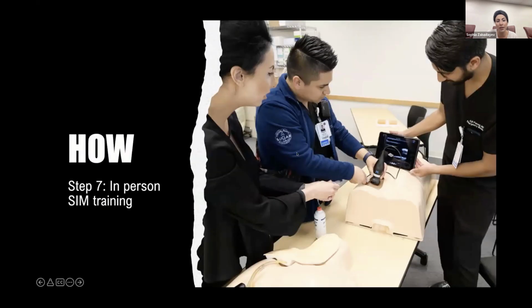And the next step was in-person training. So we had the residents come in, on one of their conference days, to scan the models and practice their in-line visualization of the needle, and look for the appropriate structures. And doing it on a conference day, I think, was really successful because we were able to capture a large audience that day and have a great turnout.